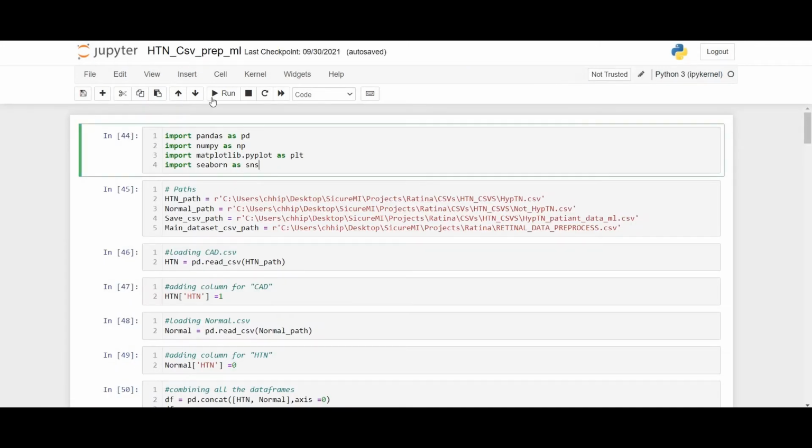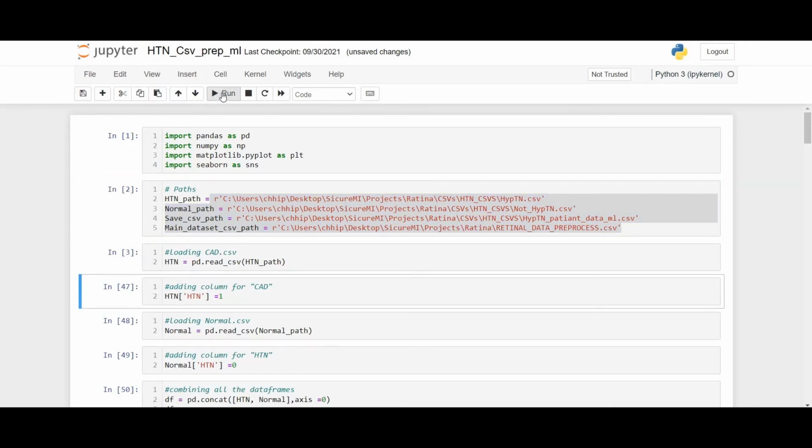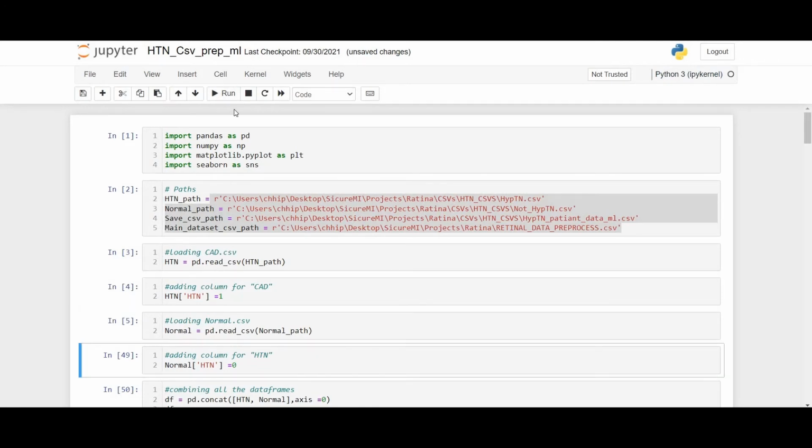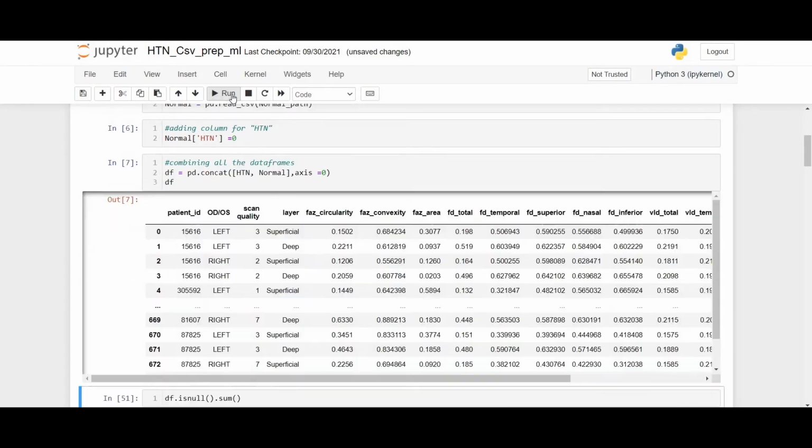Now we're going to merge both the CSV files we got after the biomarker calculations, because the hyptn.csv file contains the data corresponding to class 1 and the not_hyptn.csv file contains data corresponding to class 0. This code will merge both the files and give us the final patient data ML CSV file.